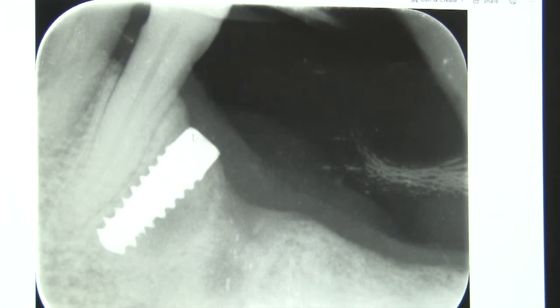It was a lot better than what you would normally get by just putting an implant in with a drill, spinning it into place, but you would expect that in this site right here, it's going to take longer for the implant to bond to the surrounding bone.